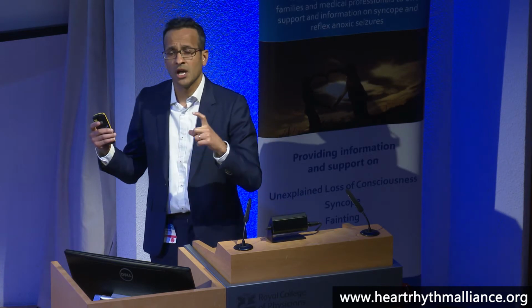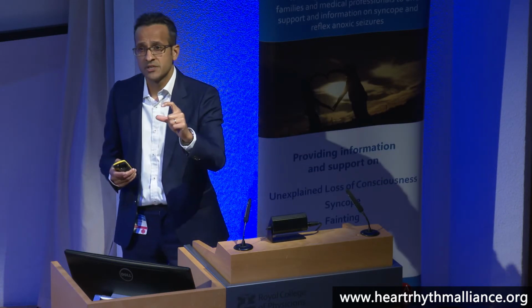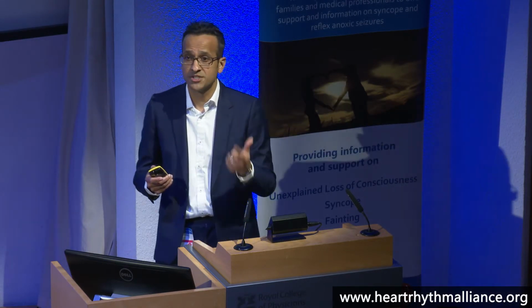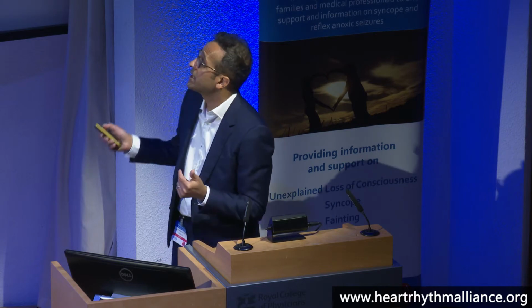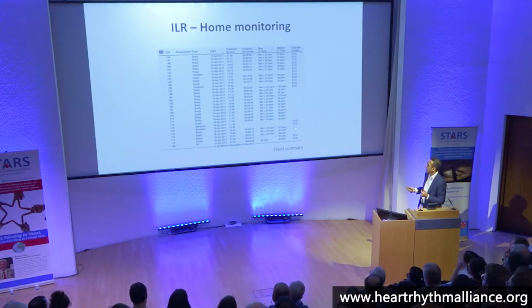The loop recorder itself, I'm talking particularly about the Medtronic one, has about 1 hour's worth of memory that it will store. 30 minutes are dedicated to the automatic brady or tachy settings, and 30 minutes dedicated to patient recorded events. That's why the ECG documentation will stop at a certain point and only symptoms will be recorded. But this is the kind of download that we will get, and we'll be able to interrogate each and every event.